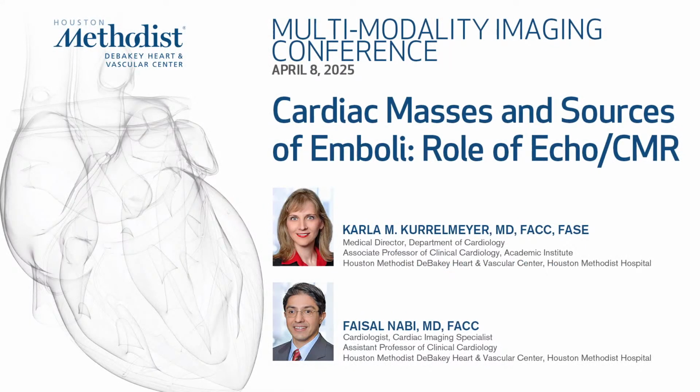Today we're going to talk about the echocardiographic assessment of cardiac masses and cardiac source of embolus. So echo, compared to the other imaging modalities, does have advantages. Everybody always assumes it has nothing but disadvantages because it's an old technology. But it has significant advantages, and they include dynamic, real-time evaluation.